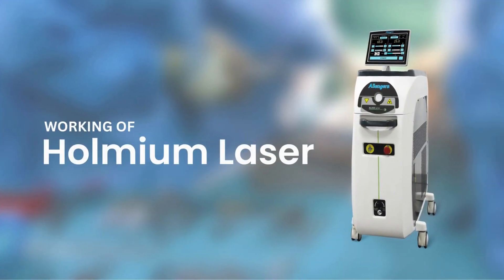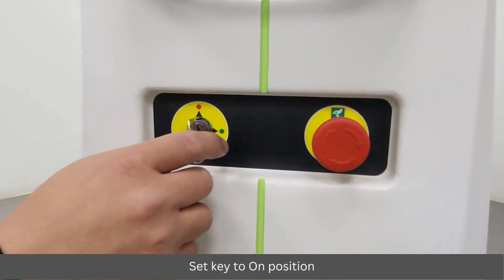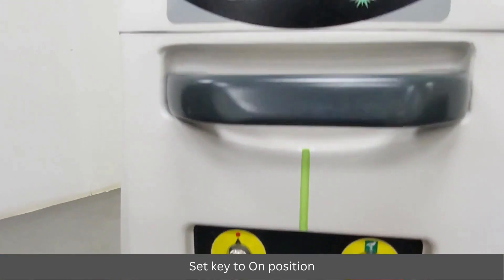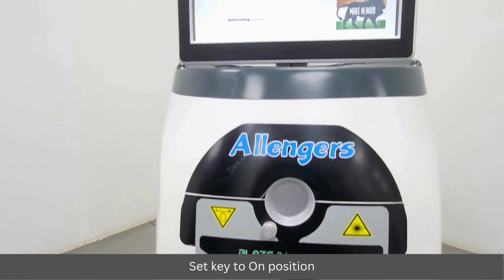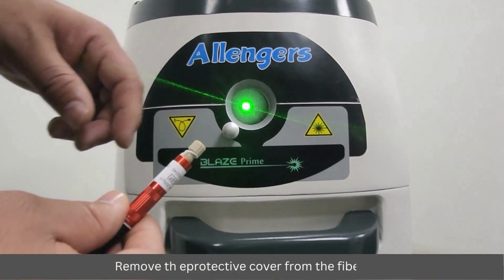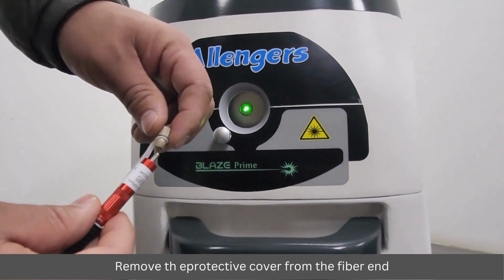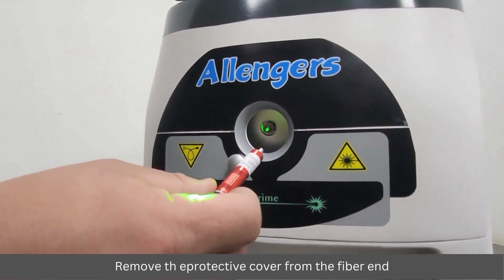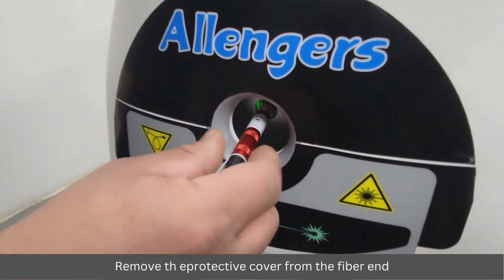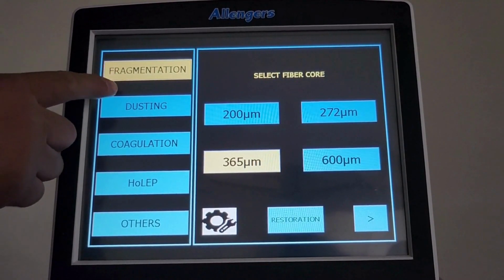Working of holmium laser. Set the key to the on position. Remove the protective cover from the fiber end and connect the fiber to the laser port. Set treatment values according to the procedure.